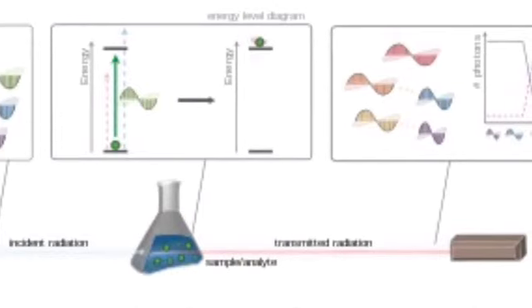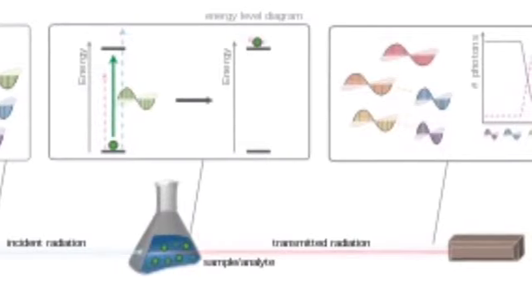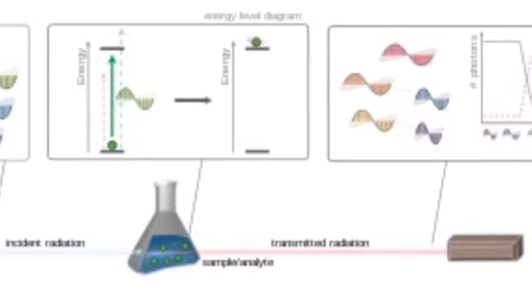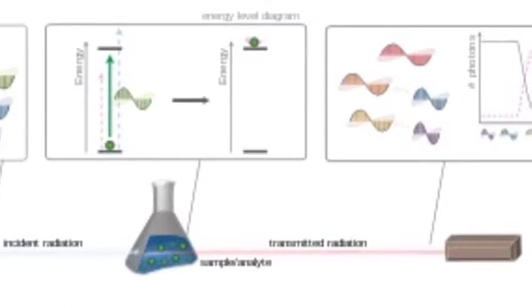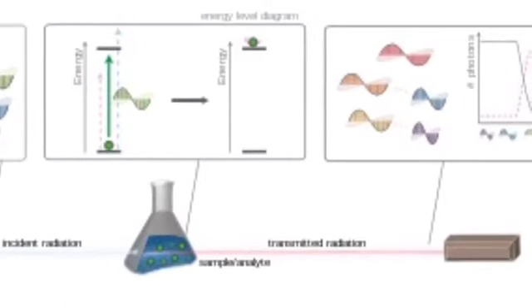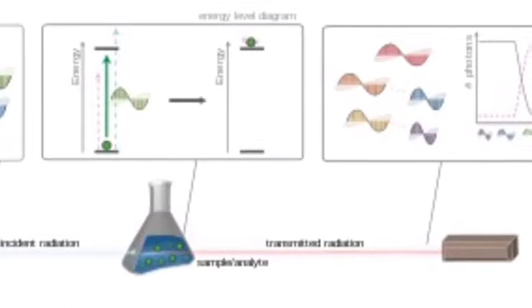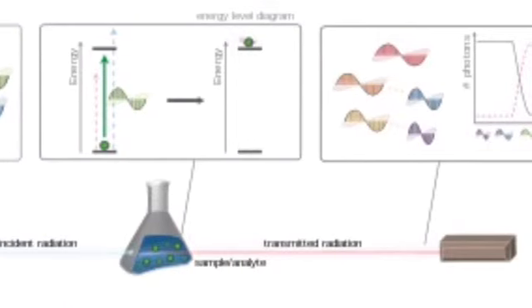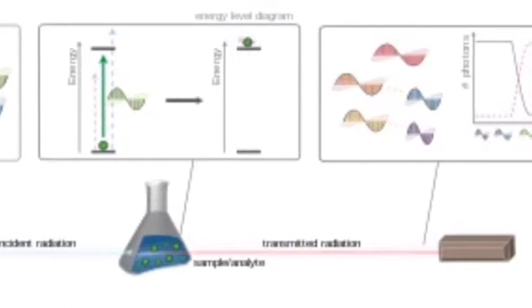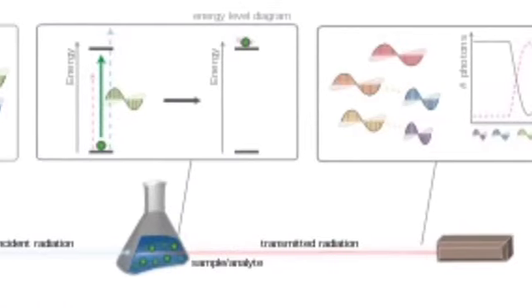Thanks to the X-rays and how our body absorbs them, there is an exam called the CT scan. It's computed tomography, CT, as it is known. A scan is an imaging method that uses X-rays to create a picture of a cross-section of the body. To perform this, you are asked to lie on a narrow table that slides into the center of the CT scanner. Once you are inside the scanner, the X-ray beam rotates around you. Modern spiral scans can perform the exam without stopping.